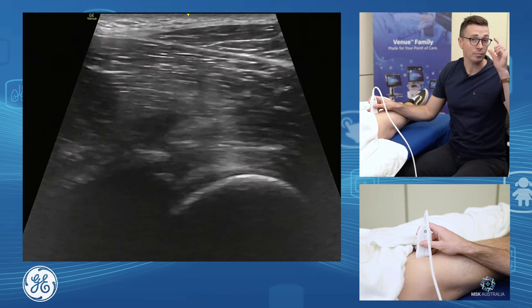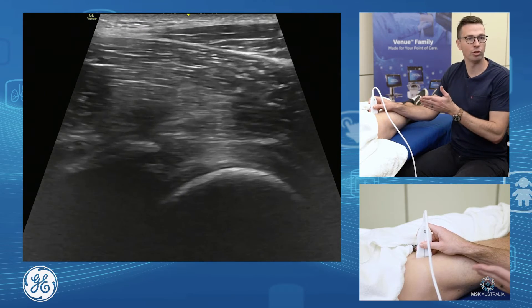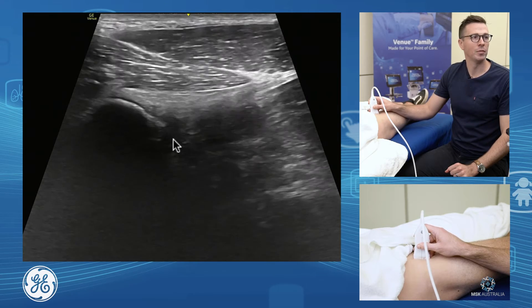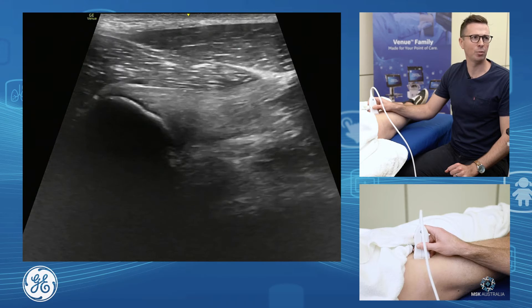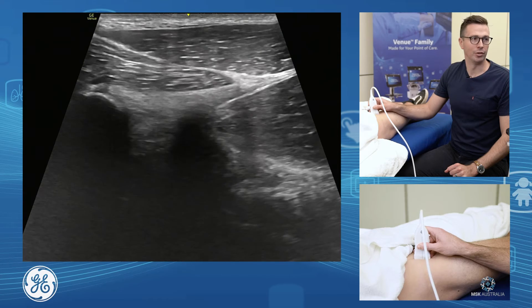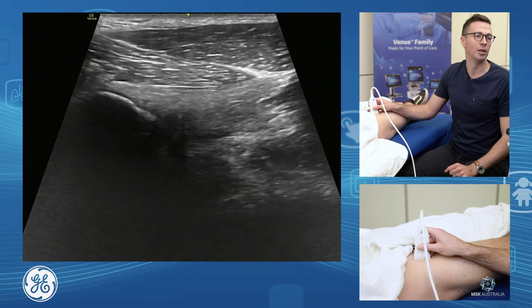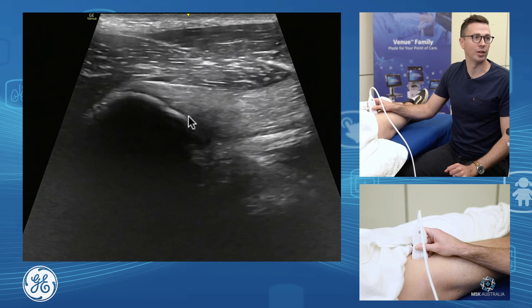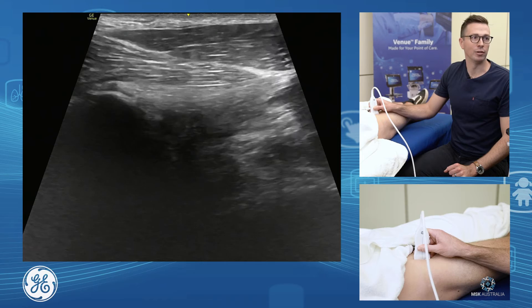The other structure we want to assess at the front of the hip is our rectus femoris. From the front of the hip joint in longitudinal, we move our probe laterally and slide up onto the anterior inferior iliac spine. This is our rectus femoris direct head. We also see our reflected head diving around to originate on the lateral aspect of the acetabulum, the lateral labrum, and the lateral capsular structures. From the direct head, you can assess for apophyseal changes, traction apophysitis, and avulsion fractures of the rectus femoris direct head.